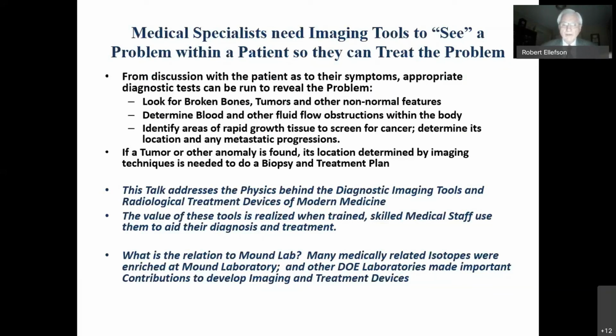So if a tumor or another anomaly is found, its location can be determined by imaging techniques, and that is needed to do a biopsy or a treatment plan. This talk will address the physics behind diagnostic imaging tools and radiological treatment devices that are used in modern medicine.